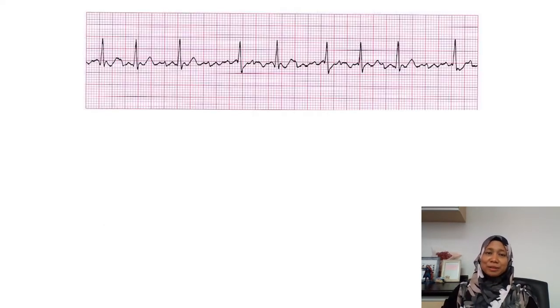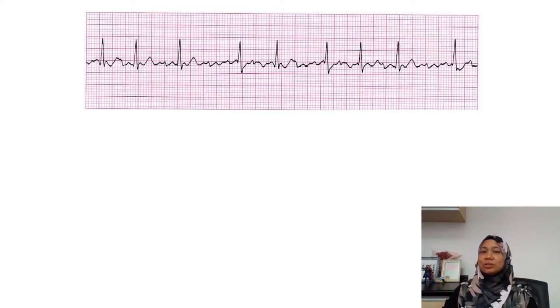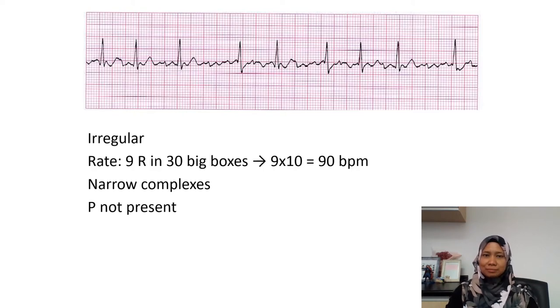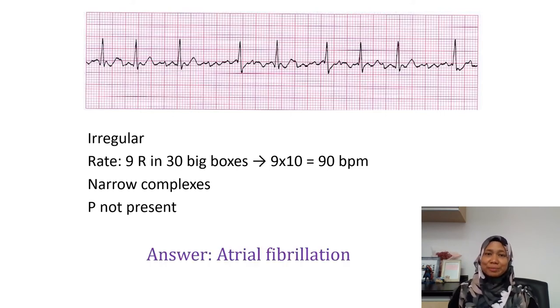The next strip shows that the RR interval is not the same, so this is an irregular rhythm. There are narrow complexes and the rate is about 90 beats per minute. No P wave is present — you cannot see a P wave there. So this is atrial fibrillation.